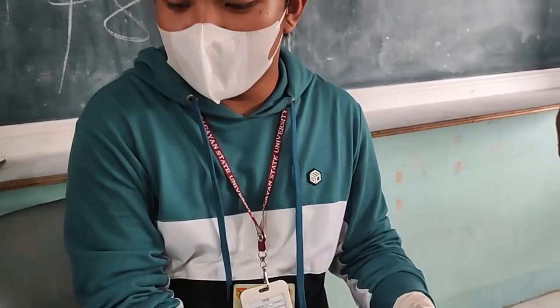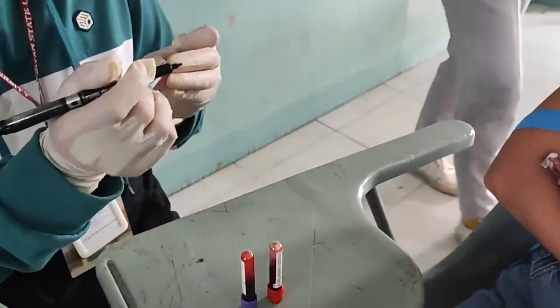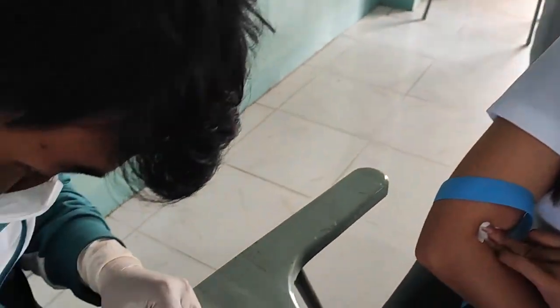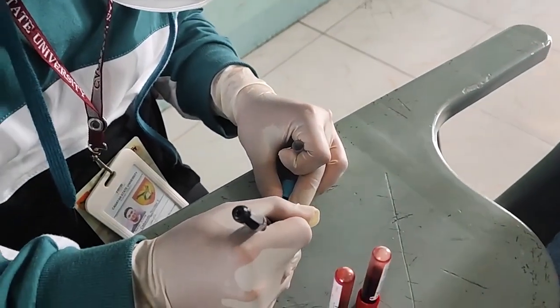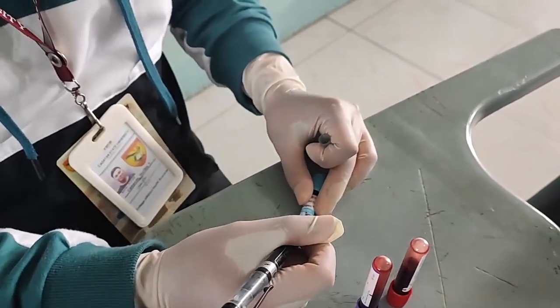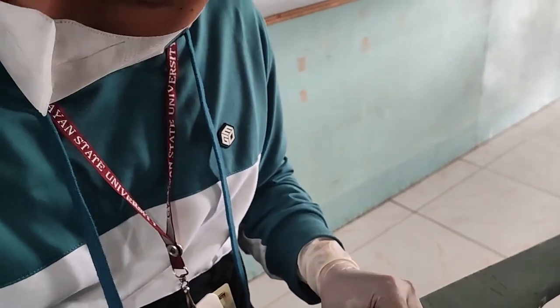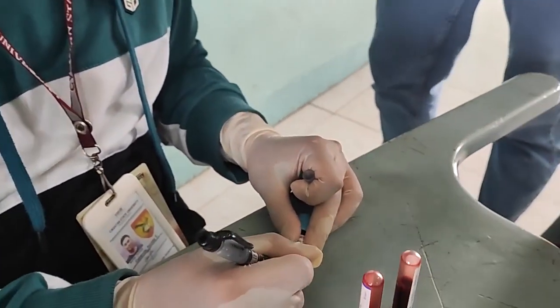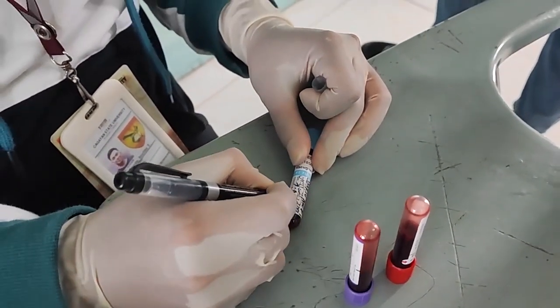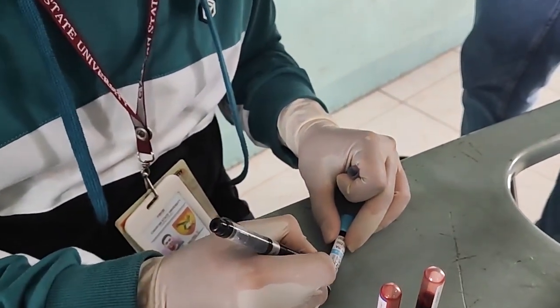And then, the last thing po na gagawin natin is yung pagle-label ng ating patient. Okay, so ang name niya po, again po, ano pong name niyo? Mr. Sunshine Medina. Mario Medina. Mario Medina. And kinolek po natin ito ng January 21, 2023, 3:06 p.m. And ilalagay ko rin po yung initial ko as the medtech.